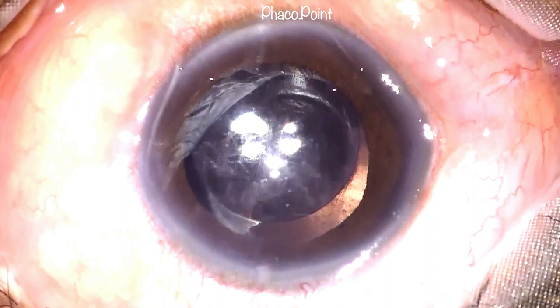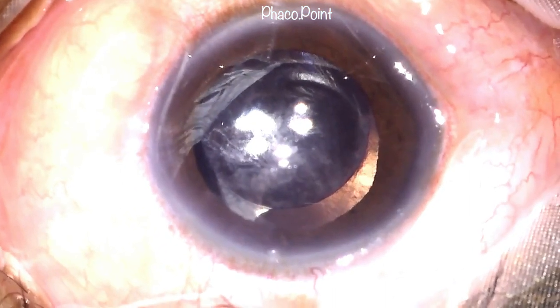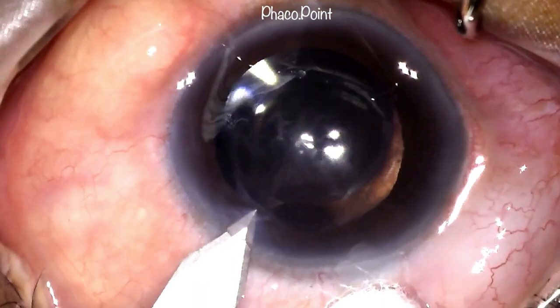After a proper counseling session, the patient was taken up for surgery. And here's how we managed this case. After an adequate peribulbar block, we start with taking the incisions.